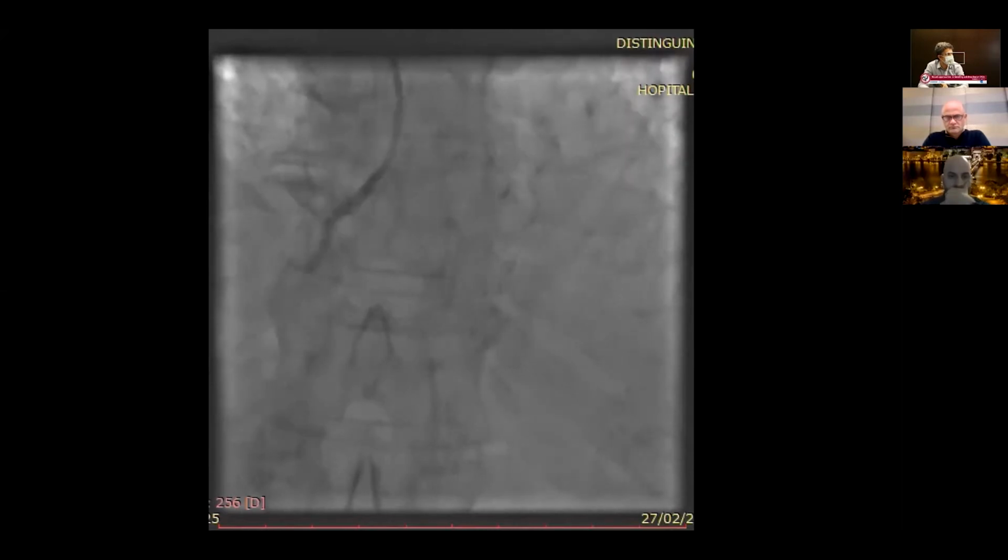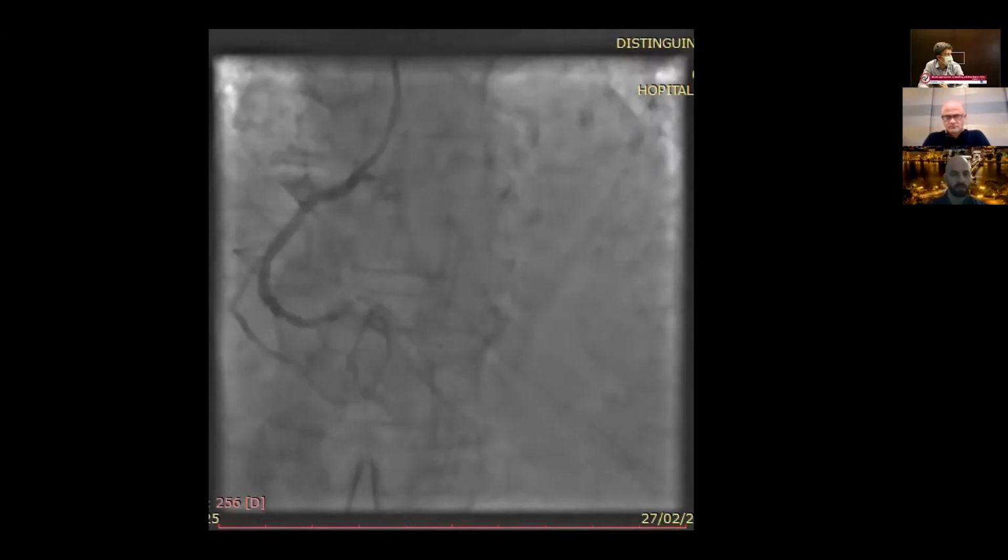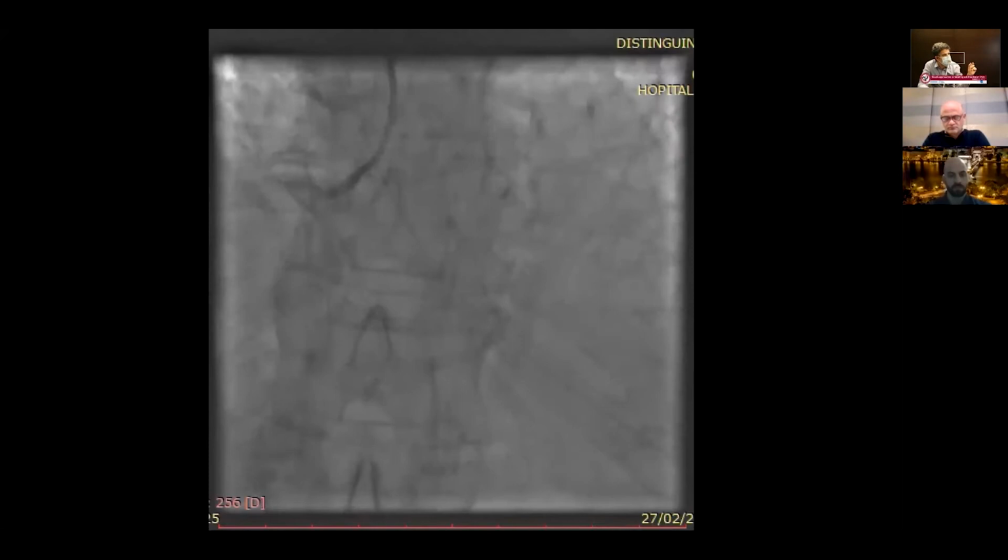It's a proximal lesion. I think it's an ideal lesion for rotablator, because that is what solved the case really. And then beyond this, again, NC balloon, of course, and delivering the stent. And yes, sometimes there is so much calcium that even after the NC balloon, the stent could be stopped by a tiny angle, and therefore you need a guide extension to deliver the stent. So it's a great case.